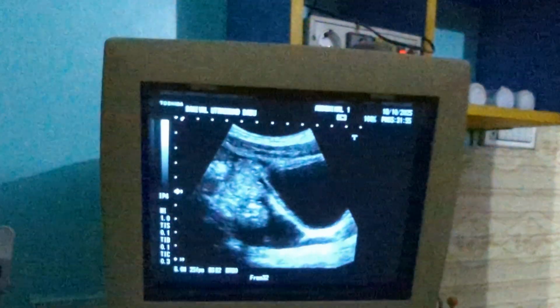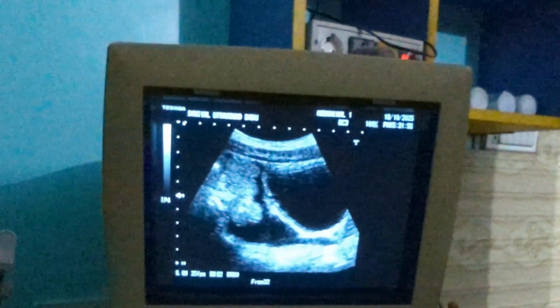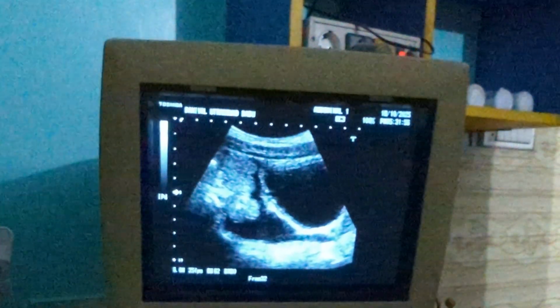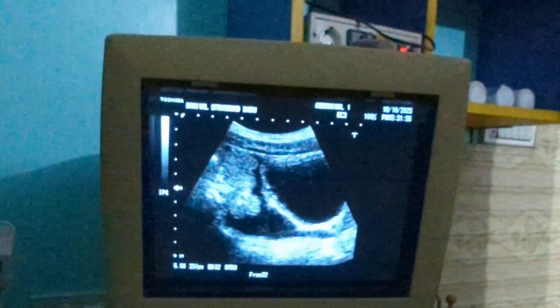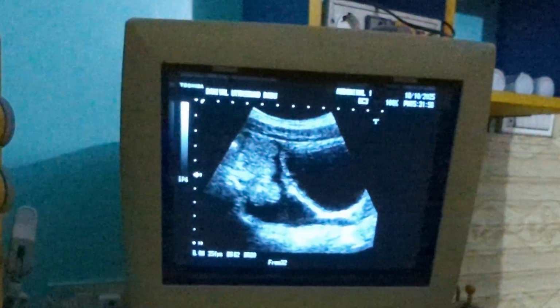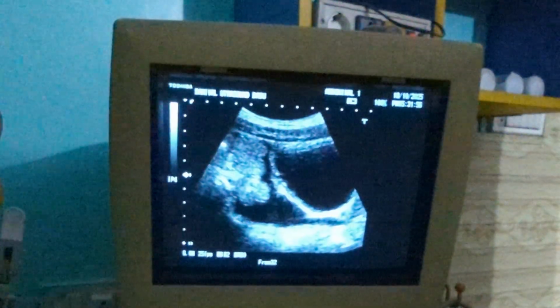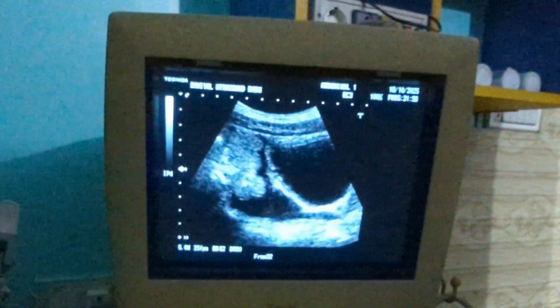We have a few things to discuss regarding the free peritoneal cavity fluid. These are the consistency of the free peritoneal fluid, which is very important to understand, and the causes. On ultrasound scan, free fluid in the peritoneal cavity appears as an anechoic or hypoechoic collection between abdominal organs, like I just showed you. It is surrounding the distended bowel loops. It's usually first detected in the dependent areas. That's why I am scanning in the lower abdomen.